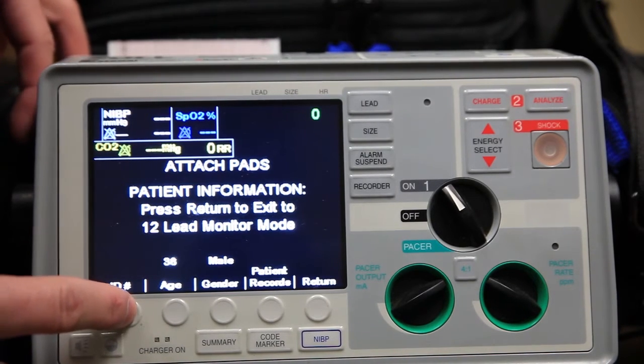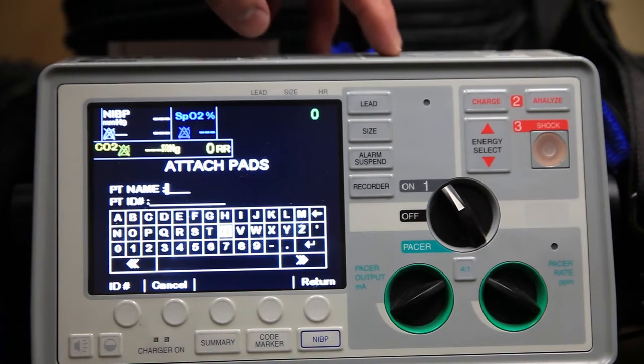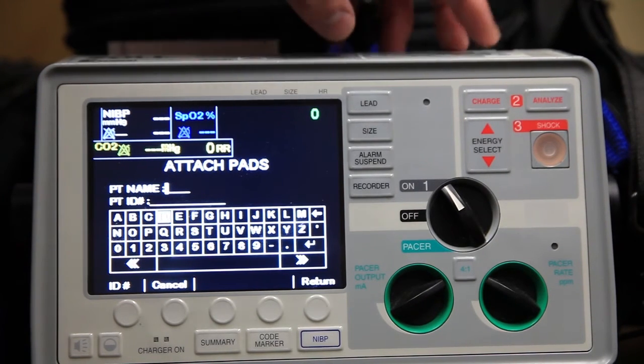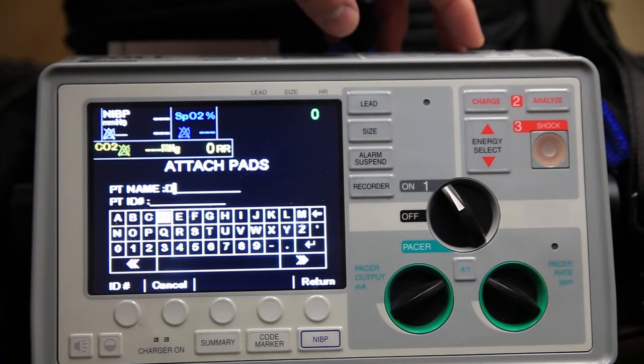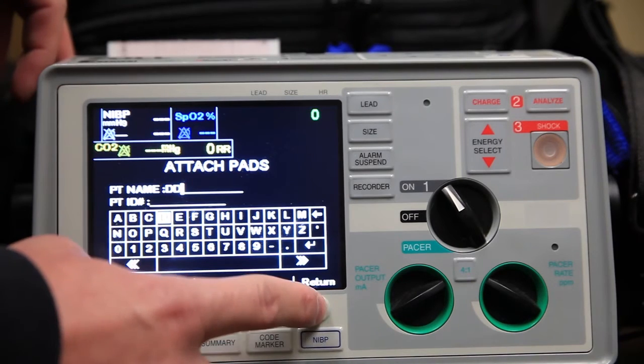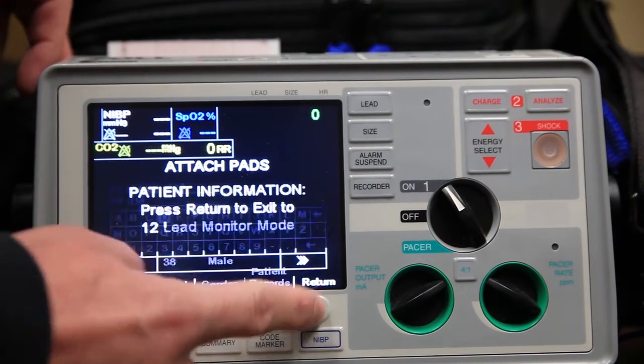We now go to ID. Here we need to enter the initial of their first name and last name, so it's consistent with the hospital records. Once you've got the initial of their first name and initial of their last name entered, return back.